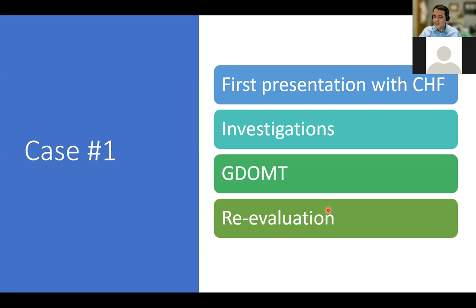This would be the classic type of patient we would consider for MitraClip. But if that coaptation gap is a little bit too big, or the depth of coaptation is too low, these cases would be quite challenging to do from a MitraClip point of view, because the result would not be good. And for the same reason, in a patient like that, where EF may be below 20%, the risk of surgery is very high and falls outside of clinical indication for surgery. So you may be looking at other therapies, such as optimization of heart failure treatment, CRT, and left ventricular support.